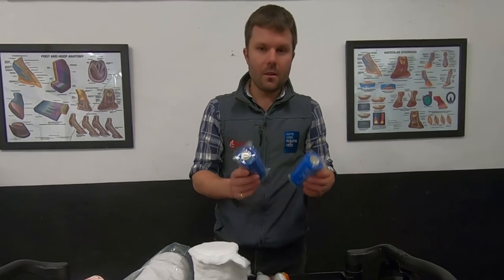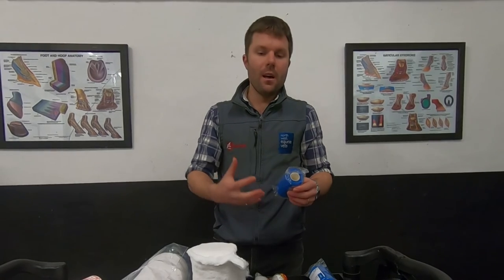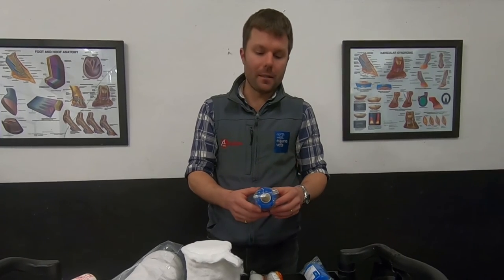Finally, good old vet wrap — nice and self-adhesive. But again, be very careful with this. You can put this on too tight, and vet wrap has this tendency that once you've applied it and the horse starts to move, it will occasionally wrap itself tighter still. So if in doubt, put this on a bit loose.